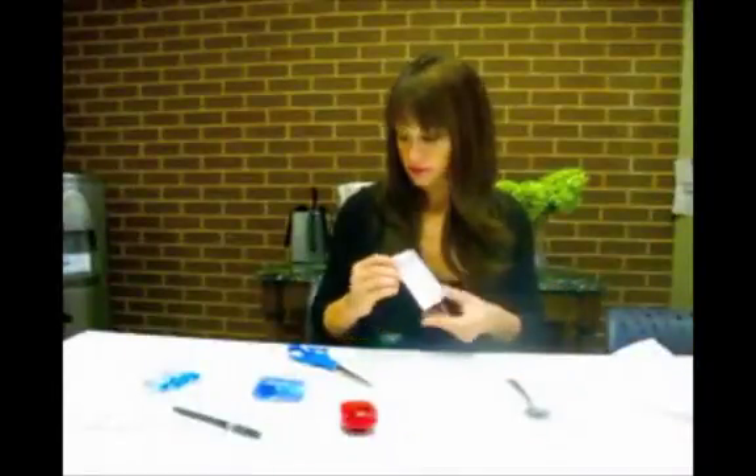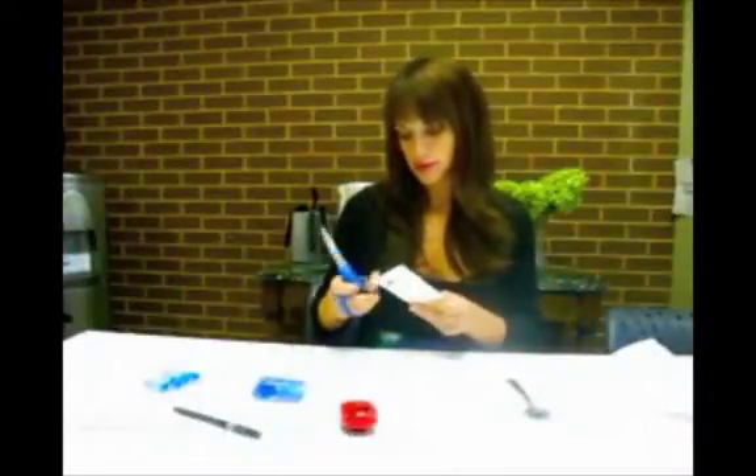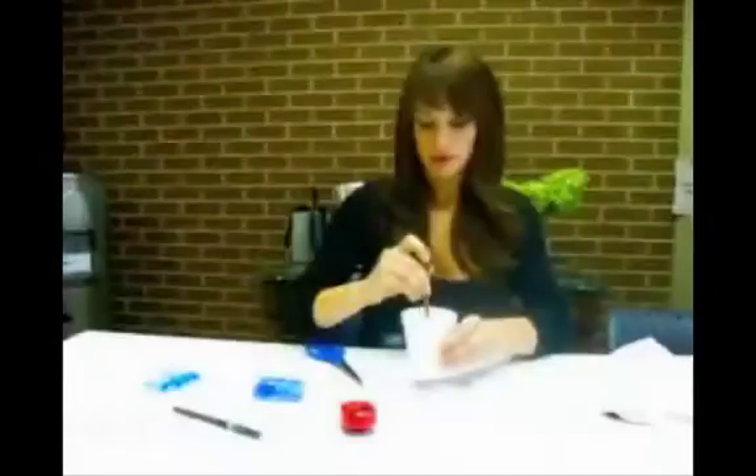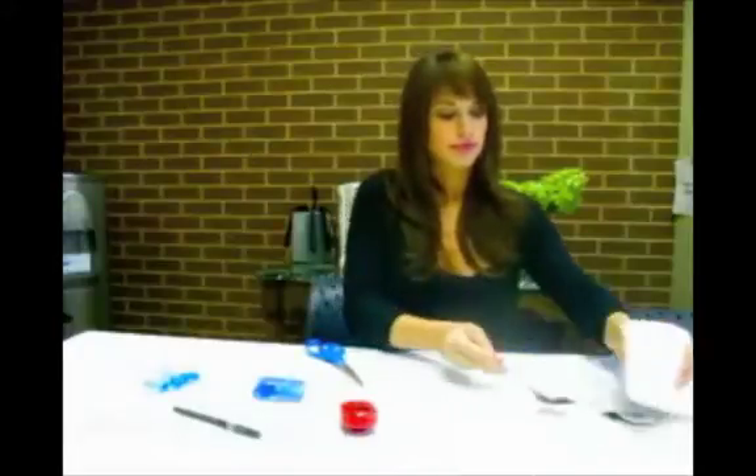After reviewing the directions, cut open the packet of lactulose. Mix the lactulose in a glass with 8 ounces of cool water. Set this aside for later use.